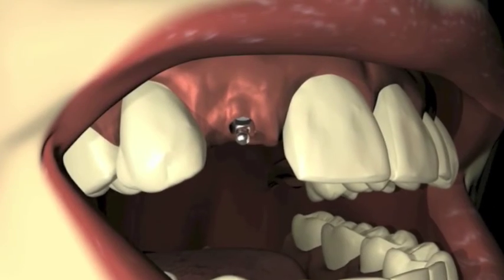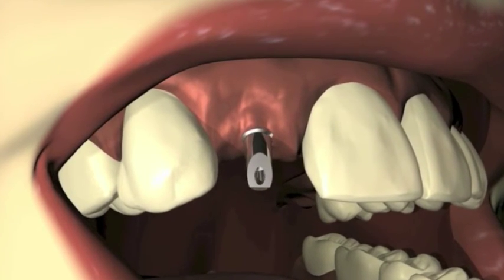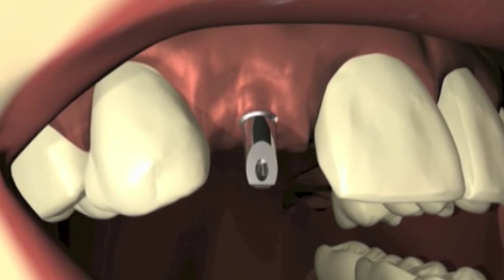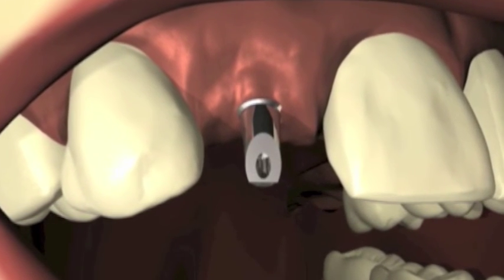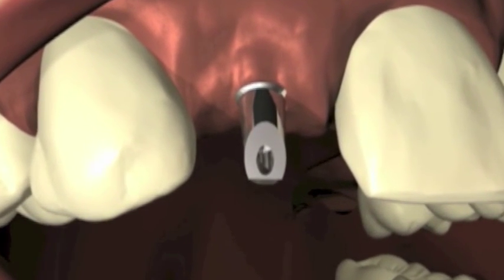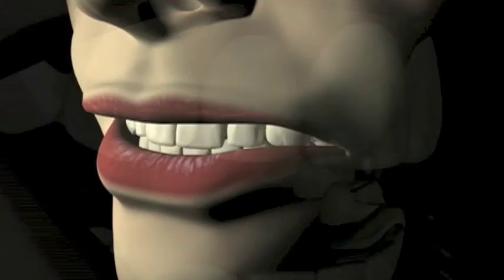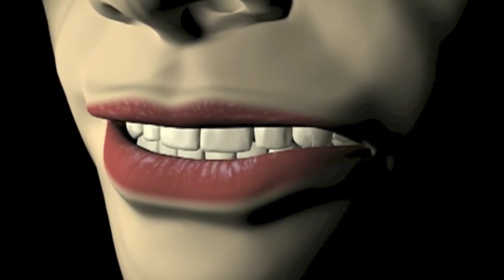The abutment and restoration are returned from the lab. The abutment is placed in the mouth and, if clinically acceptable, is cemented with resin cement. Only a resin cement is acceptable. The final restoration is then placed and the fit, aesthetics, and proper occlusion are confirmed, both visually and radiographically.